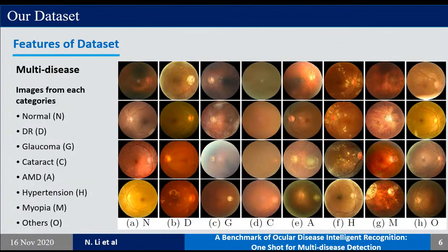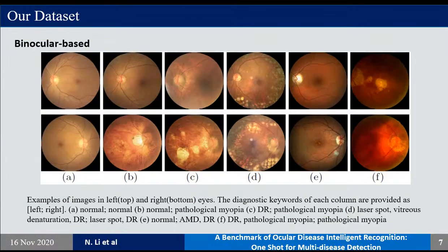Clinically, ophthalmologists may give diagnosis results of various diseases by observing one fundus image. Therefore, as a dataset containing multiple fundus diseases, our dataset is closer to clinical application scenarios.